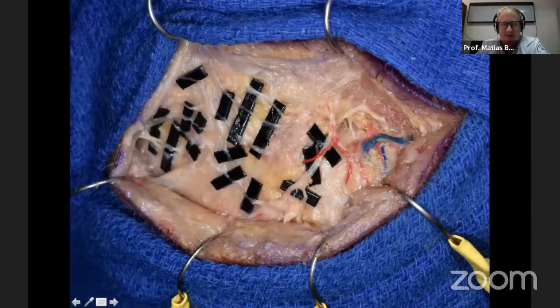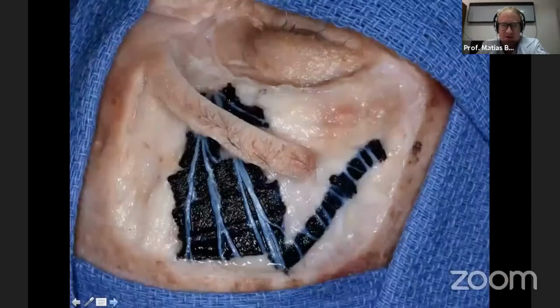This is an important thing to keep in mind when we perform these keyhole surgeries, because our incision should be lateral to the supraorbital nerve and in a curved fashion, in order to preserve these branches that arrive at the frontalis muscle in this region. Here, a right dissection preserving the eyebrow. We have here all the ramifications of the supraorbital nerve and some connections with the frontalis ramus of the facial nerve.